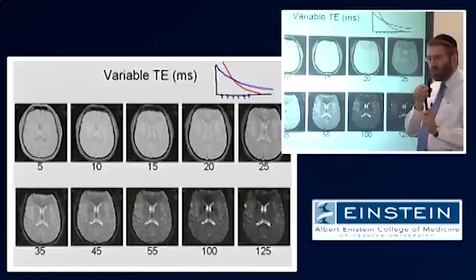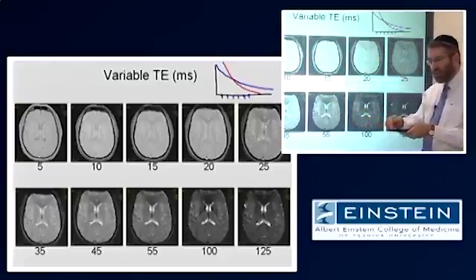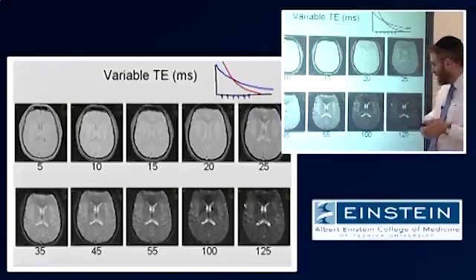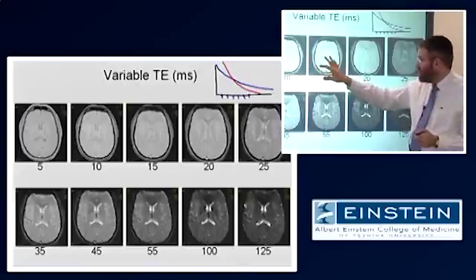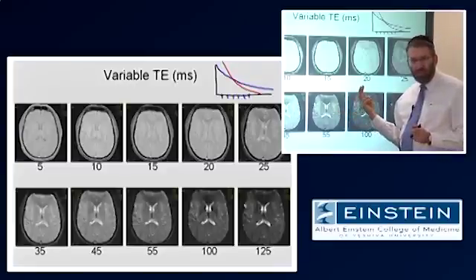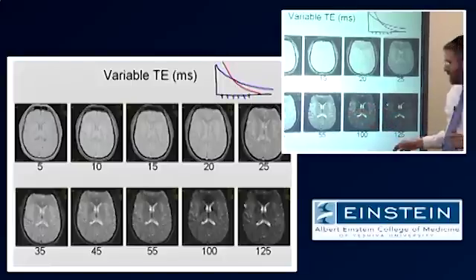So the fact that that's not the case here is telling us that we used a short TR and ended up with this situation as our starting point, where tissue has higher signal than CSF. And only as we wait over time, because CSF is losing signal more slowly, do we eventually get to the point where CSF has higher signal than tissue. Okay? So again, everything you see changing in these images is a function of differences in T2 between tissues, which become much more prominent as you get to a longer echo time.